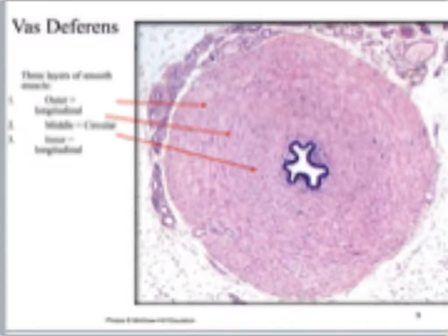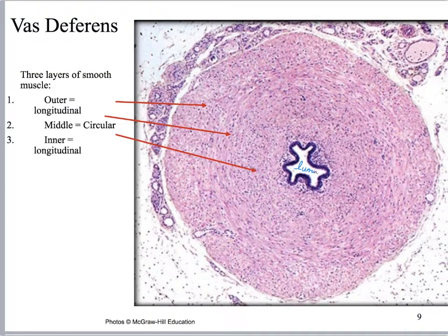All right, so now we're looking at the vas deferens, and the big thing I want you to take home is how thick that smooth muscle is, okay? That's the primary dominant feature that you're going to notice when you look at this under a histology slide. So the epididymis has smooth muscle too, but it's more like that thick, okay? Whereas this has got super thick. Seminiferous tubules don't have it, really. I mean, there are little strands here and there, but not really. So the vas deferens needs to do much stronger peristaltic contractions, basically sending the sperm along at Mach 1, all right? So it's got all of that smooth muscle in order to assist with that.